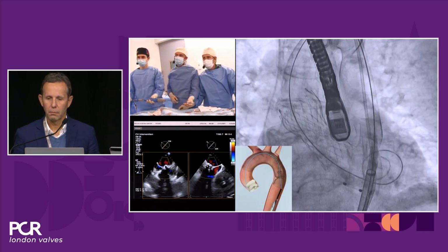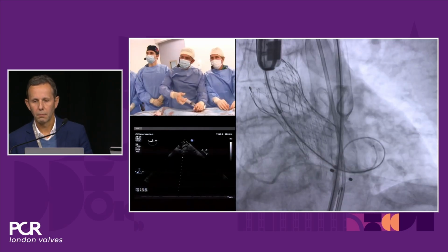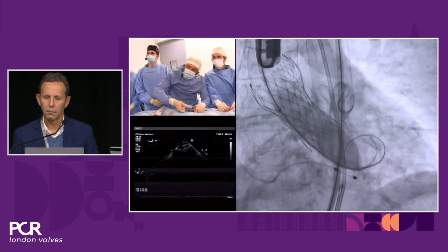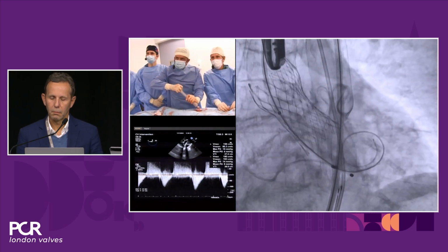Again, no interaction with the filter. Here, look. 23 balloon. The gradient is already good. What was not good was this. Pace off.